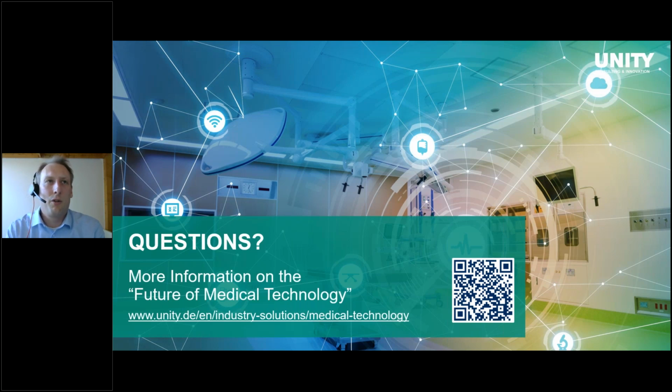Of course, it shouldn't overlap with already existing standards like DICOM, so you probably wouldn't do the image transfer based on SDC, but if it's about the controlling, maybe the measurements, that could definitely be implemented also in vitro diagnostic devices based on SDC. If there's more interest and we want to go into the details, as mentioned before, you can contact me or one of my colleagues from the OR.NET Association.